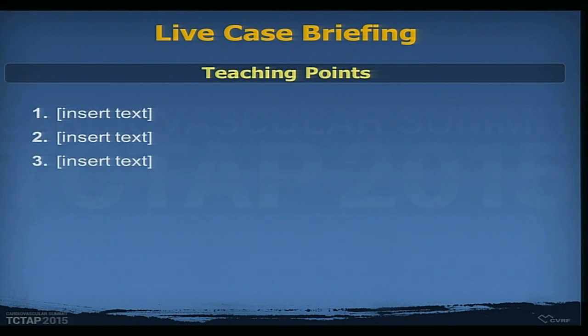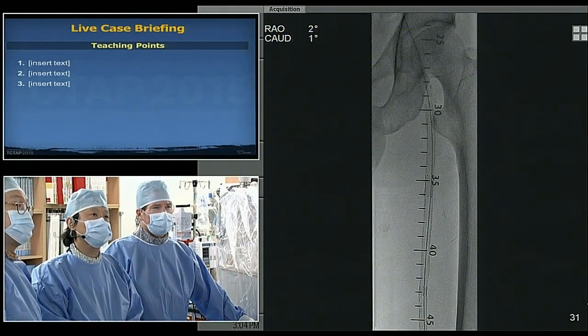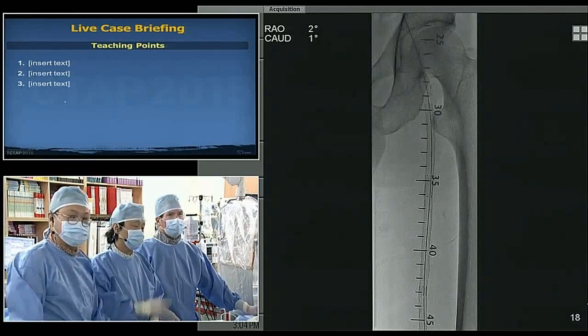We're going to show the peripheral angiogram for the left SFA lesion. Could you show us the first shot? This is the angiogram from 4 months ago.